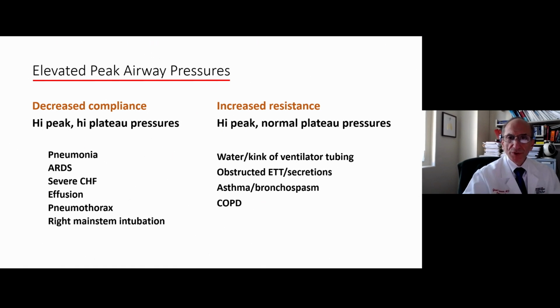That would hold true for pneumonia, congestive heart failure, flash pulmonary edema, and similarly, a large pleural effusion or a pneumothorax, not a resistance problem, but it would be calculated as a compliance problem because it would increase the pressure required to inflate the lung. Resistance problems would include things like a kinked or bitten ET tube if somebody's biting down. Bronchospasm, of course, would be the more typical, what we might see, or somebody with an asthma or COPD flare.